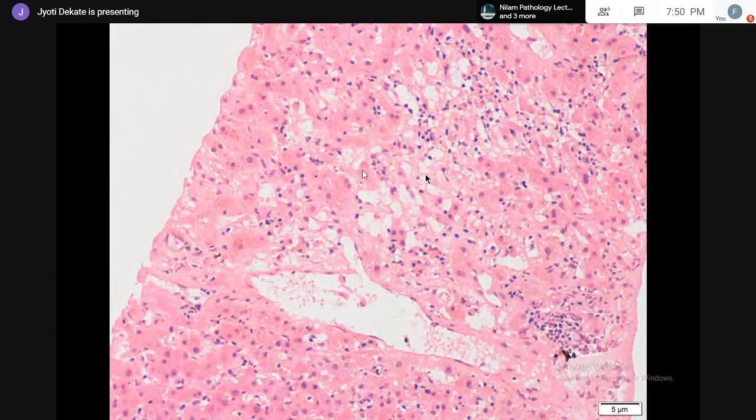Now, coming to the lobular parenchymal changes. These were the changes in the portal area which I have already mentioned. So this is how the parenchyma looked in this case. If we see here, this is the hepatic vein branch, the central vein, and these are the hepatocytes. There are many foci of lobular necroinflammation, foci of confluent hepatocytic necrosis. We can see some cholestasis within the hepatocytes, intrahepatocytic, and there is evidence of some central venulitis.